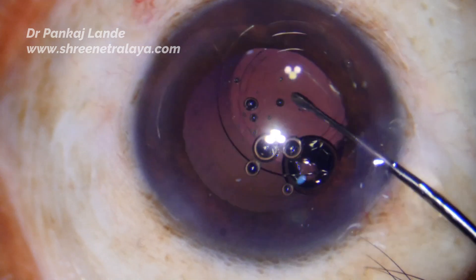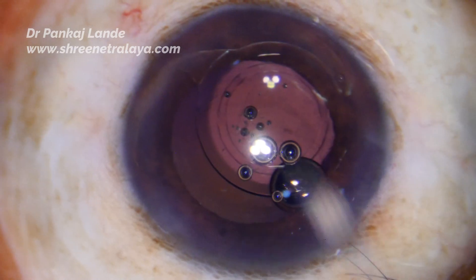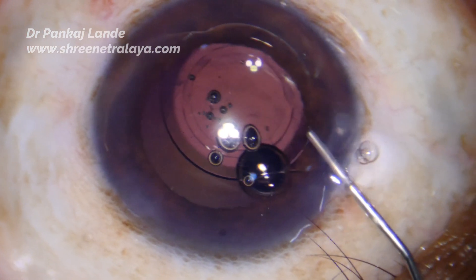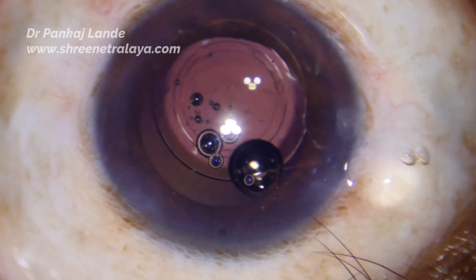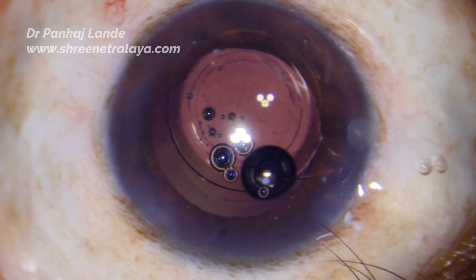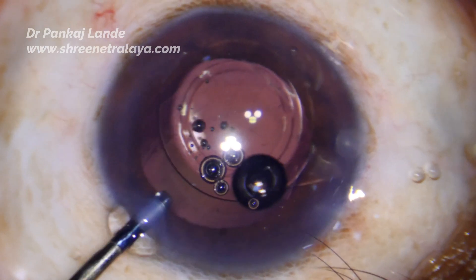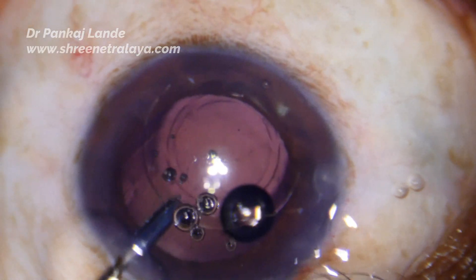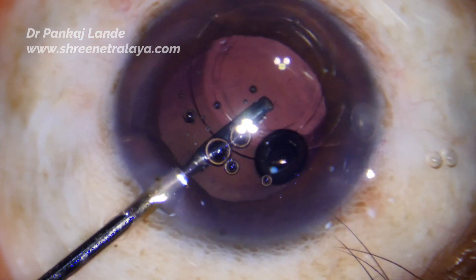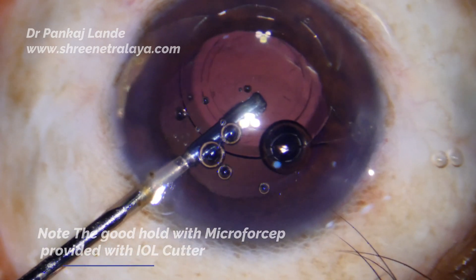Do not hurry for such cases — take your time, take a two-minute break, no harm. Plan your surgery properly and have all instrumentation on the table, sterilized or from your cupboards. Take them out slowly and comfortably. In my left hand I am having a micro forceps which is stout and has a firm grip over the IOL.